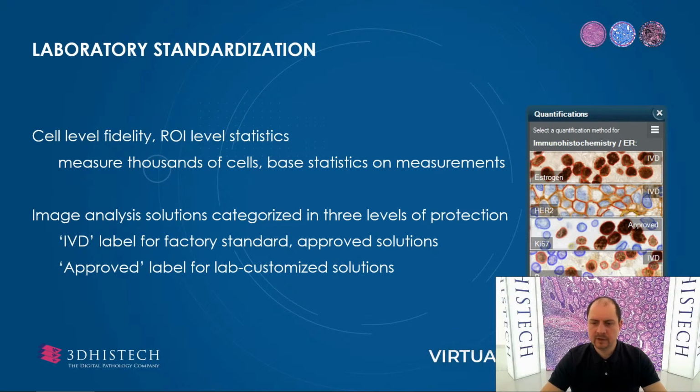This will replace the IVD labeled one in the UI. This is probably best done after conducting a lab level study to ensure precision and reliability. And the factory presets are protected against accidental deletion. So this means that these approved scenarios are only replacing their place and they are not deleted. By deleting the approved solution, the IVD approved one will pop back into its place on the UI.